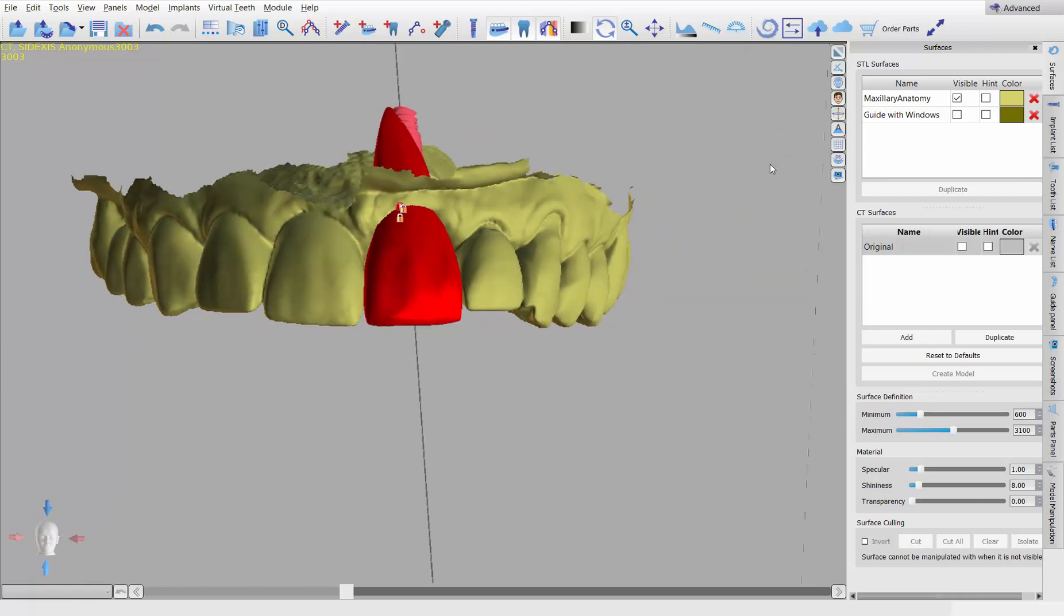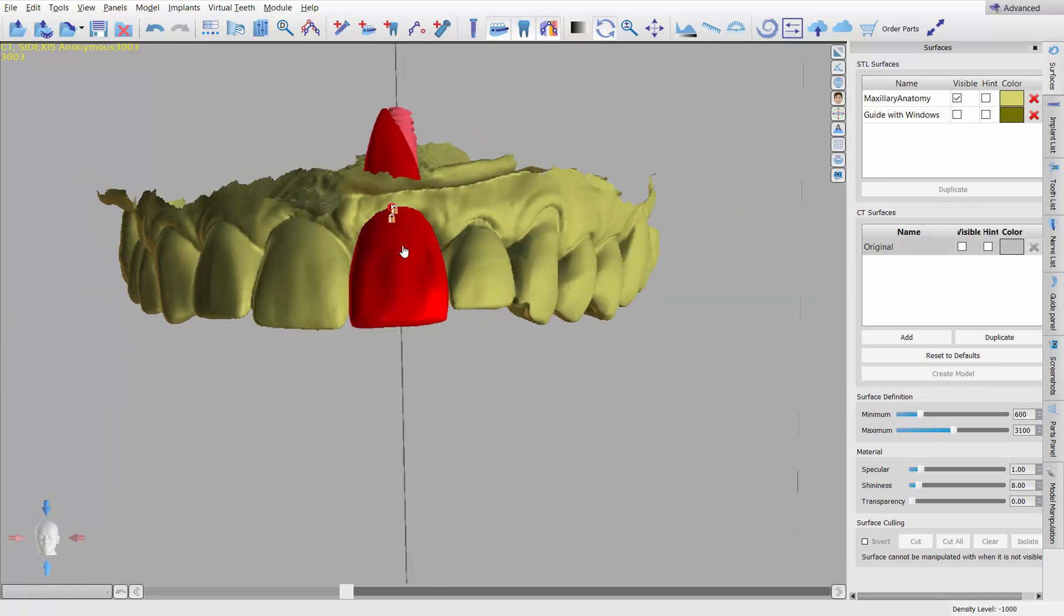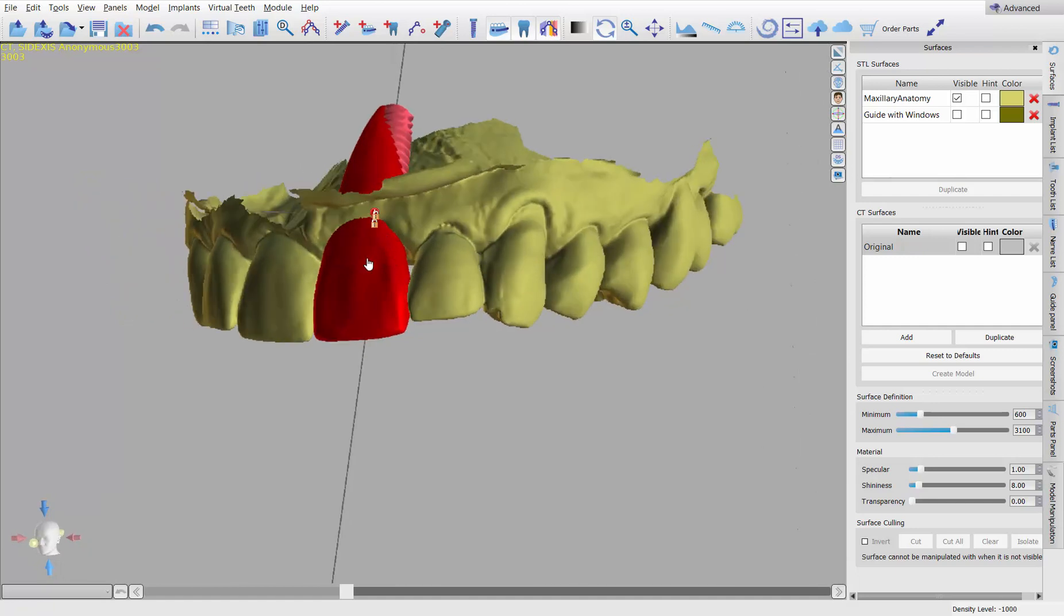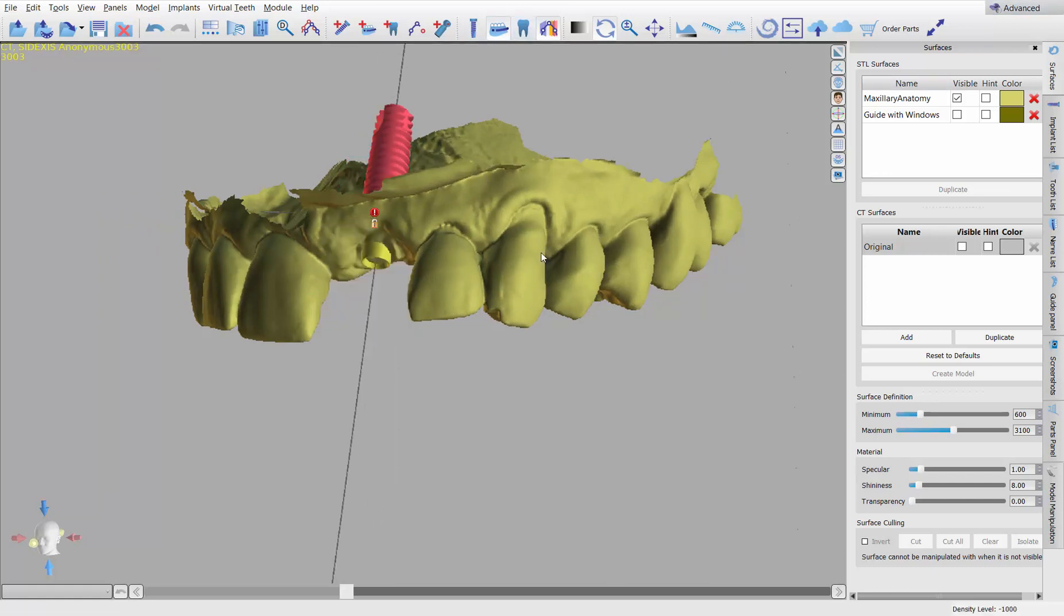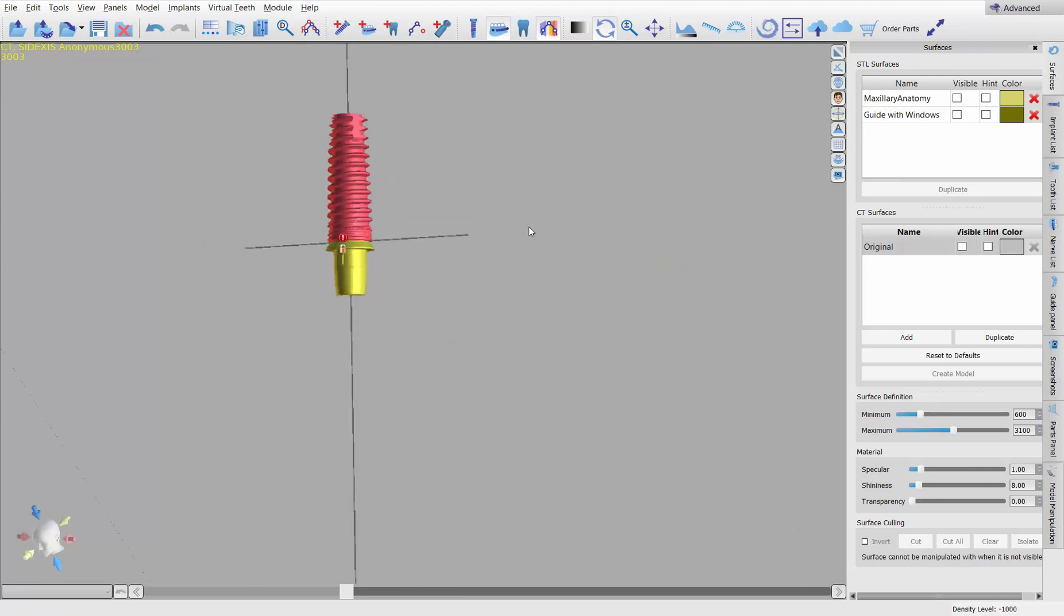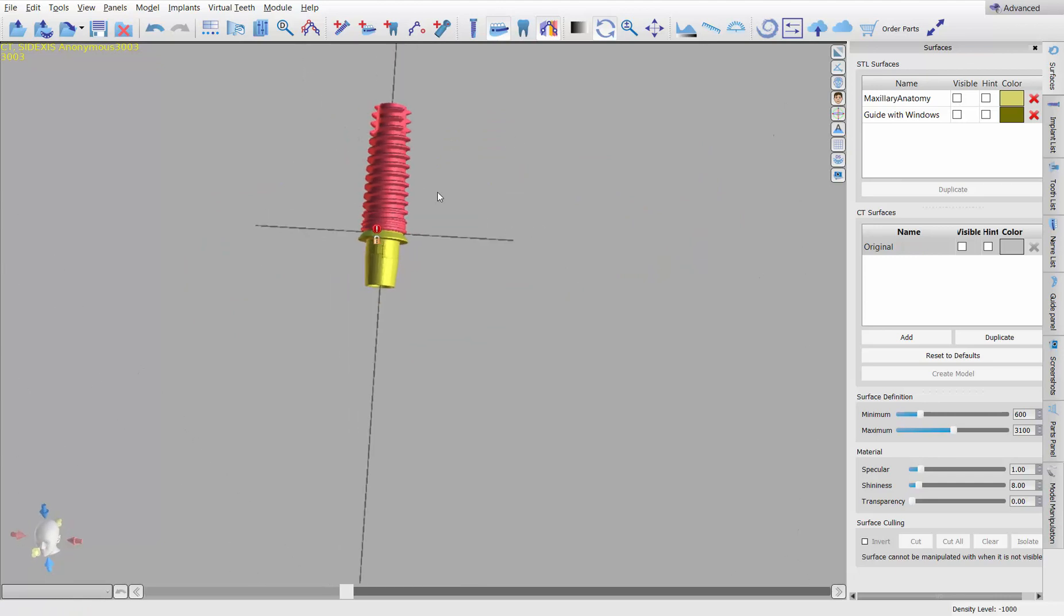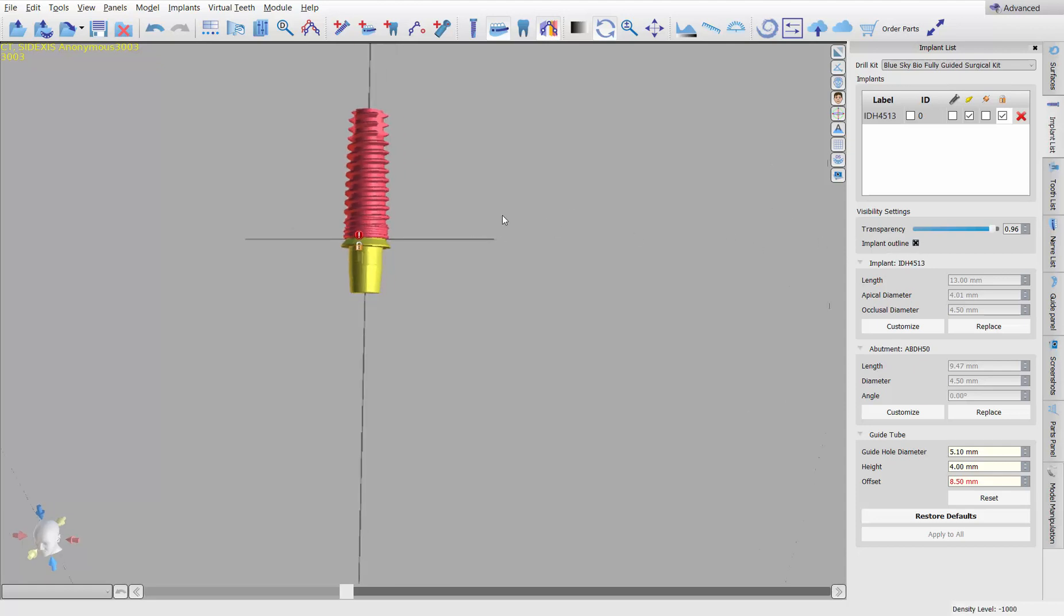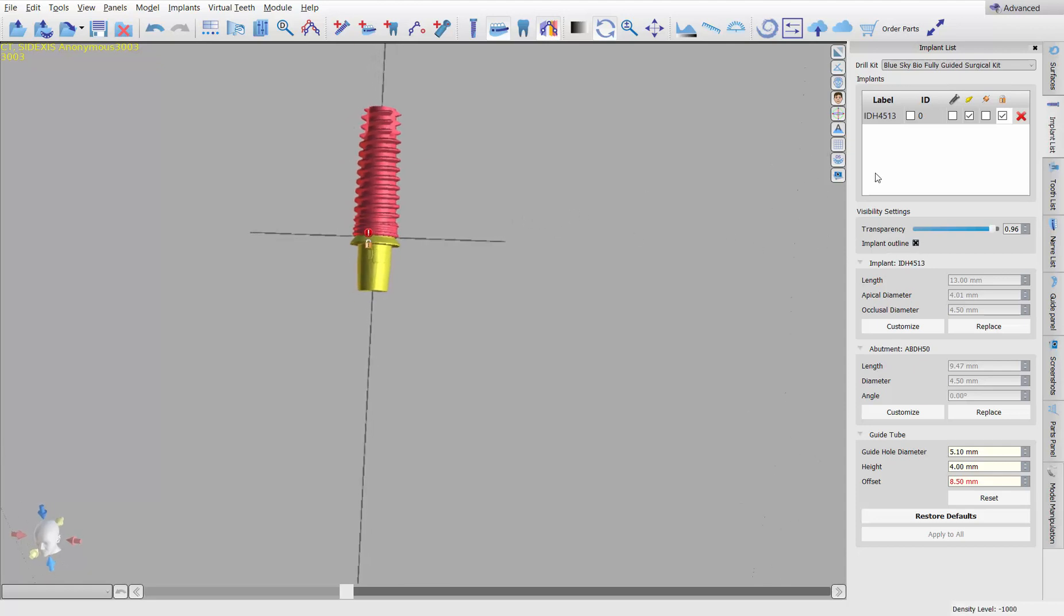All right. So what we've got here in Blue Sky Plan, we need to export a few things. We need to export the model. We need to export the virtual tooth and we need to export the implant abutment. So let me hide the tooth and let me even hide the model. And you can see that the implant has the abutment on it already. And let's go ahead and turn off the implant.